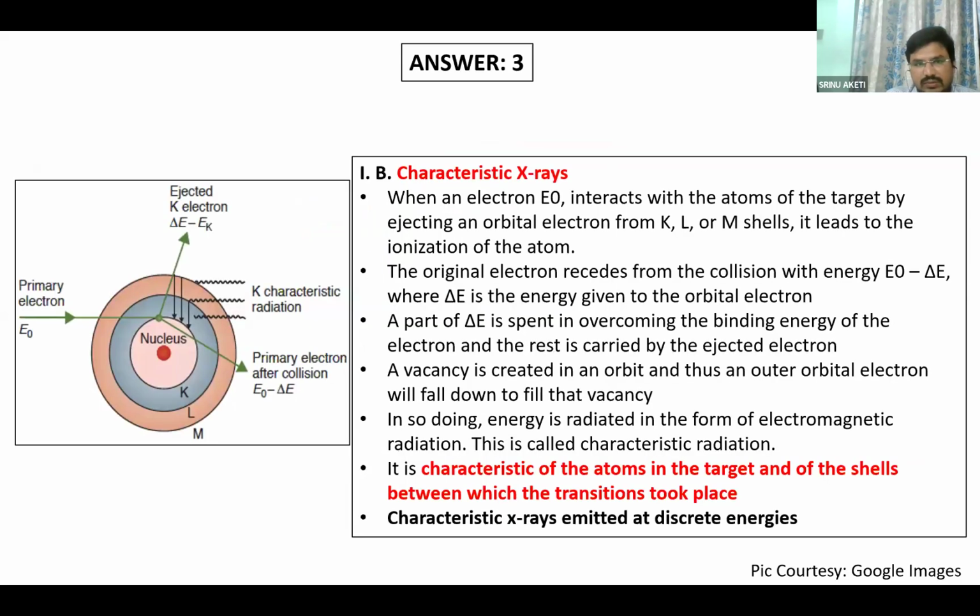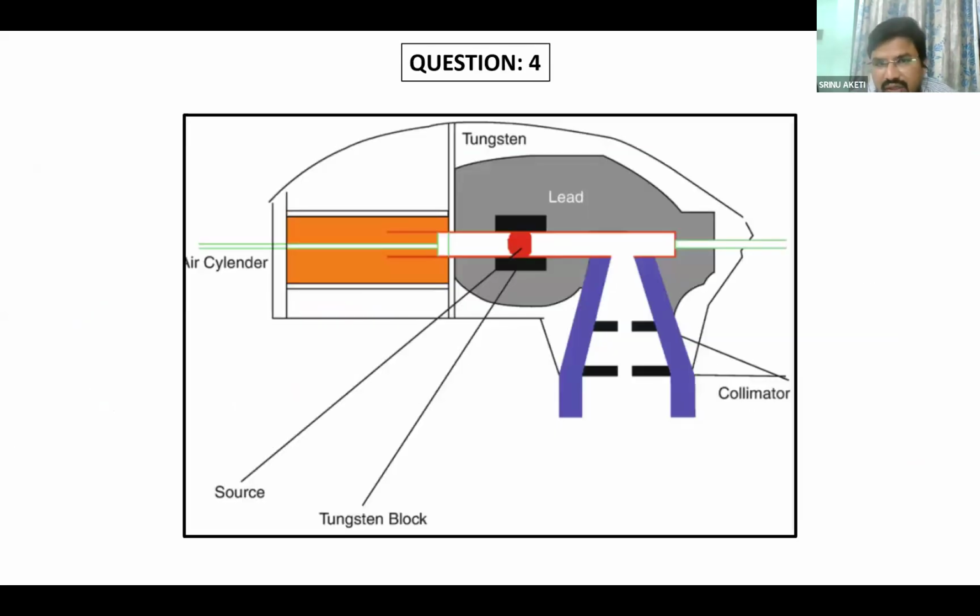Madam, can you identify the picture? Can you say something about what it is, the advantages, disadvantages? Have you ever experienced it? Yes, sir. It is a Cobalt 60 machine, sir.